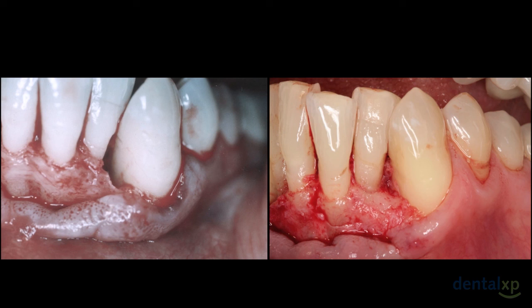So today we've been able to look at a way to do bone regenerative procedures that is very simple, and we use Emdogain, which hopefully will stimulate bone regeneration, and a scaffolding device that I now use is BioOss Collagen. Hopefully this has given you enough information that you can at least consider this option. Also, one of the biggest factors in using Emdogain is it prevents epithelial migration, which removes the need for any type of barrier. I appreciate your time and have a good day.